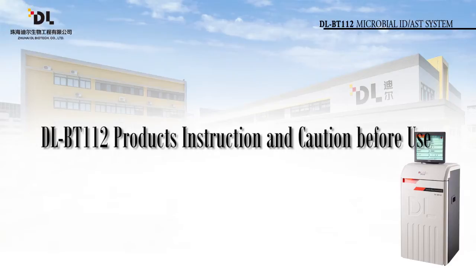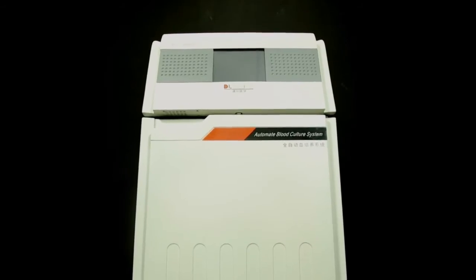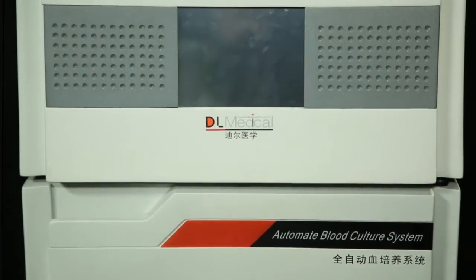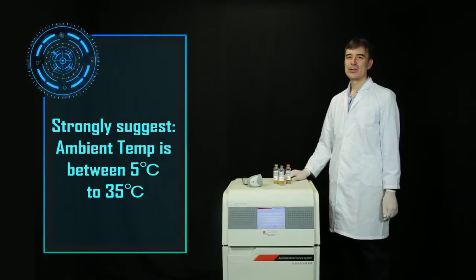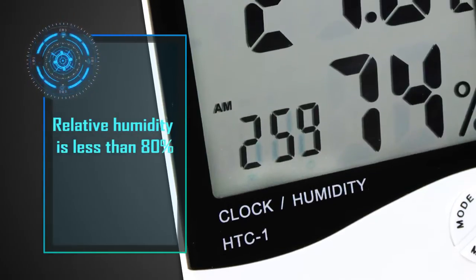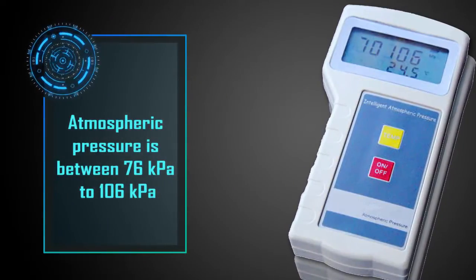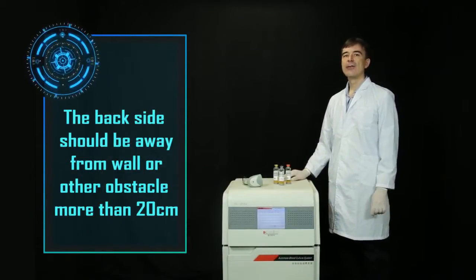Section 2: DLBT-112 product instruction and caution before use. When first opening the packaging, please handle the instrument upright according to the sign to avoid damage — do not knock or pry. The automated blood culture detection system requires a clean environment. Avoid direct sunlight and do not direct air conditioner airflow at the instrument. Ambient temperature should be between 5°C to 35°C, relative humidity less than 80%, and atmospheric pressure between 76 kPa to 106 kPa. The back side should be kept more than 20 centimeters from walls or other obstacles.